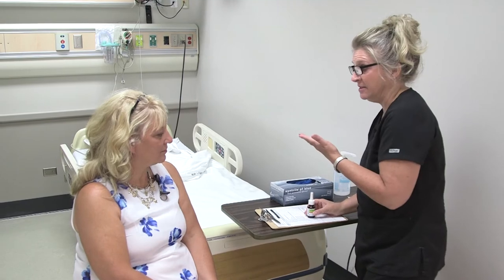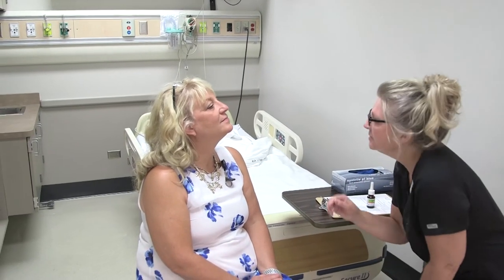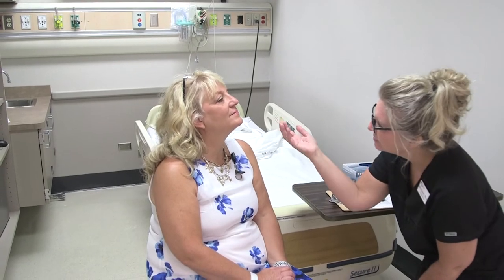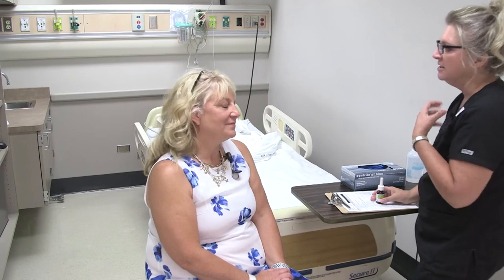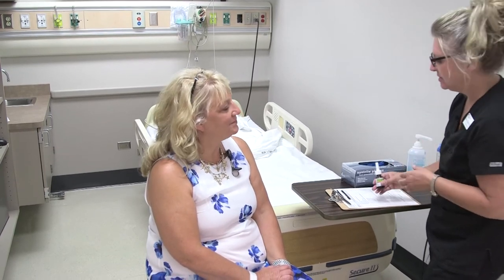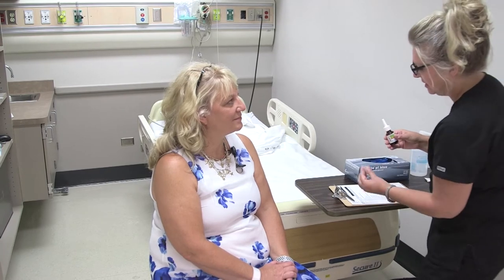Before we begin, I need to do a quick assessment of your nares. I have my pen light over here. I'm looking for any gross swelling, redness, or drainage — looks really good. Do you feel congested at all? Okay, so this is appropriate for your allergies.